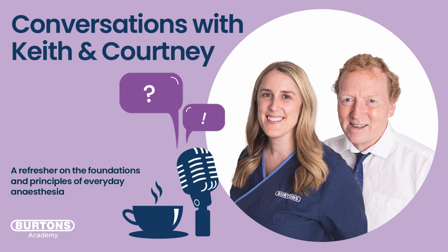So we're ventilating our patient, everything's happy and steady, but our end tidal is going 41, 42, 43, 44, 46, 48, 51, 53. Now you're starting to get worried because this has gone outside of the bounds of what it should be. What do I do? Well, you've got to increase the minute volume. And the simplest thing to do initially, assuming you're at a nice steady state, is to increase the respiratory rate.